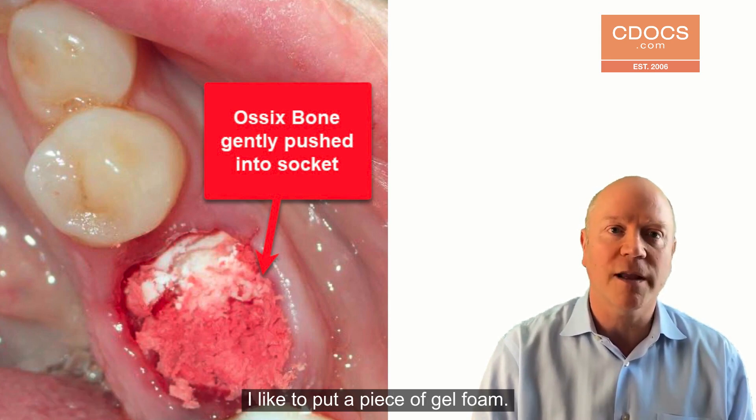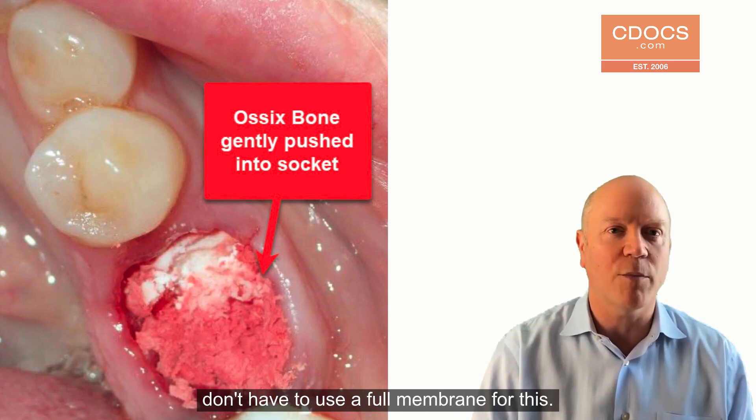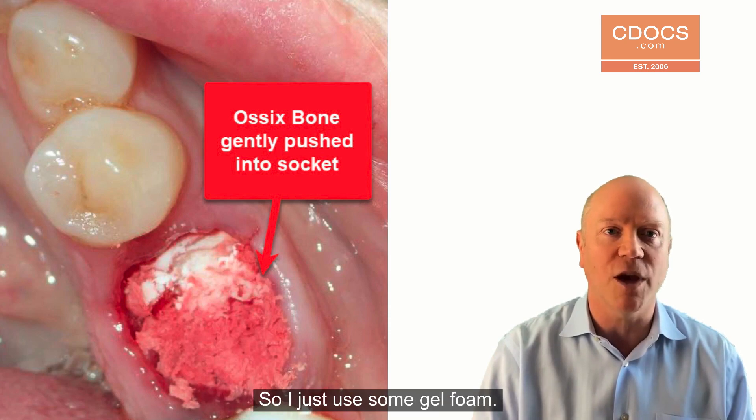Now we're ready to suture. I like to put a piece of gel foam — you can also put some coloplug or a membrane over. But you really don't have to use a full membrane for this, so I just use some gel foam.